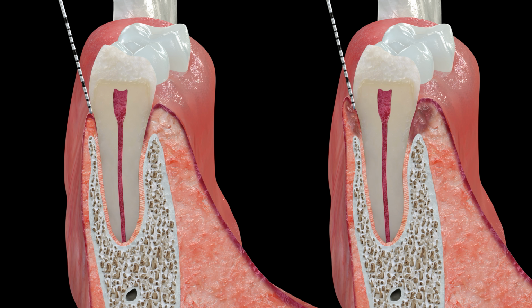This comparison highlights the differences in probing depth and tissue response between healthy and diseased periodontal conditions. Proper periodontal probing is essential for diagnosing and managing periodontal diseases effectively.